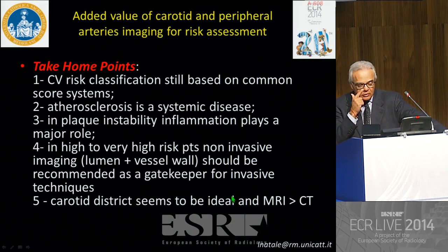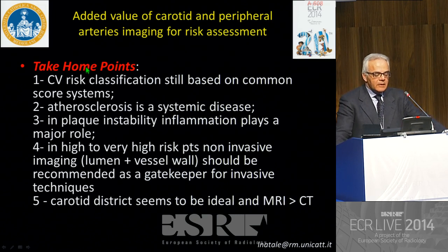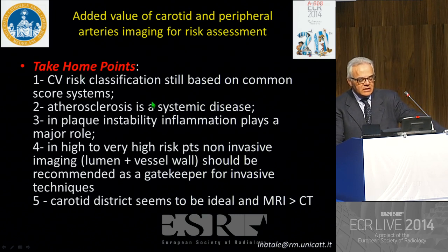So which are the take-home points of this short discussion? First of all, cardiovascular risk classification is still based on common clinical score systems, whatever it is in the Western countries, in the States, or every society has its own system, but more or less all are well recognized. Furthermore, atherosclerosis is a systemic disease and should be considered as a systemic disease at all. And in plaque instability, that is the most relevant point for the cardiac events, inflammation surely plays a major role.